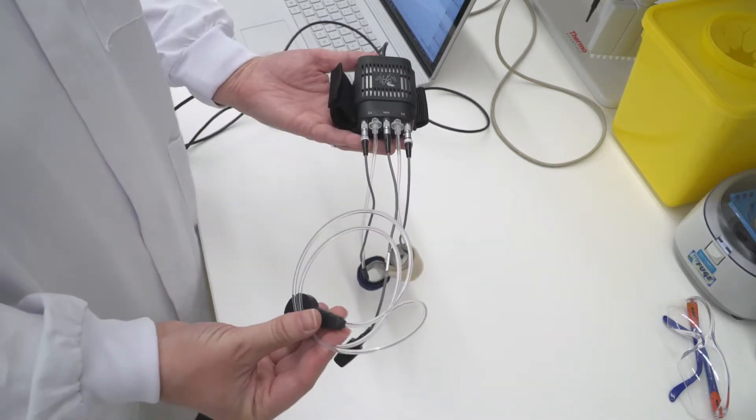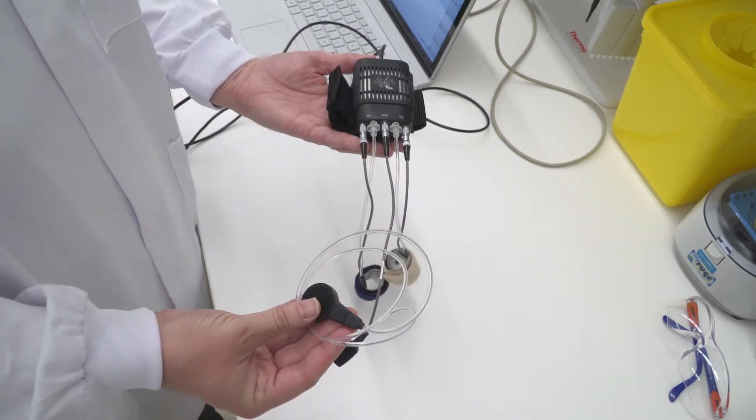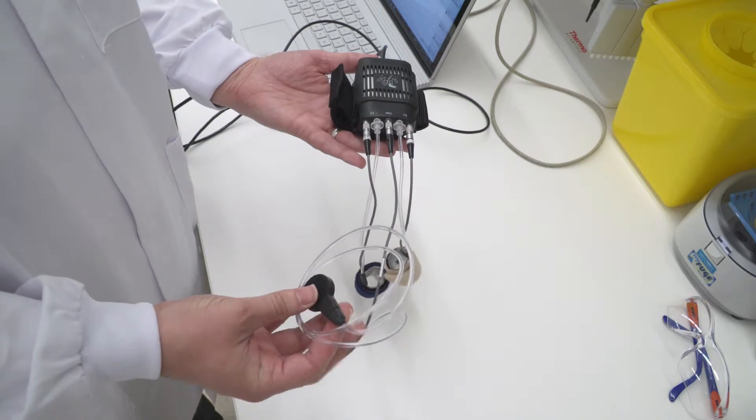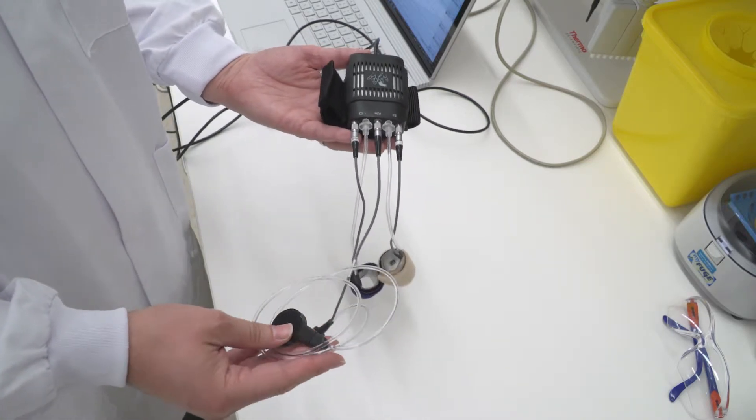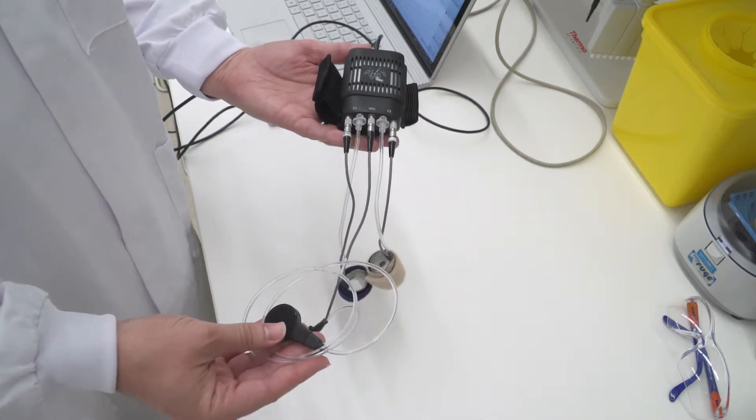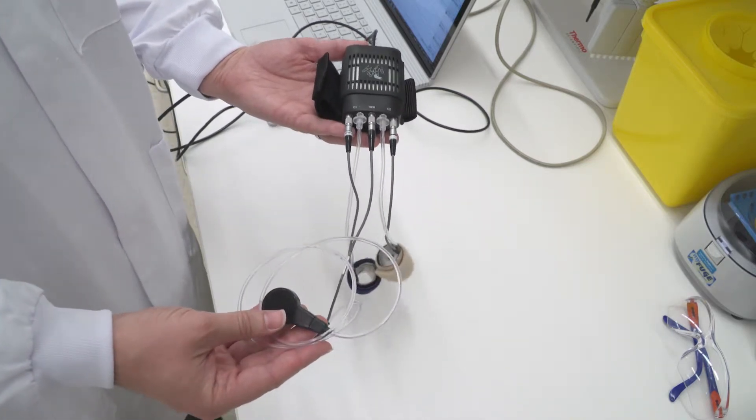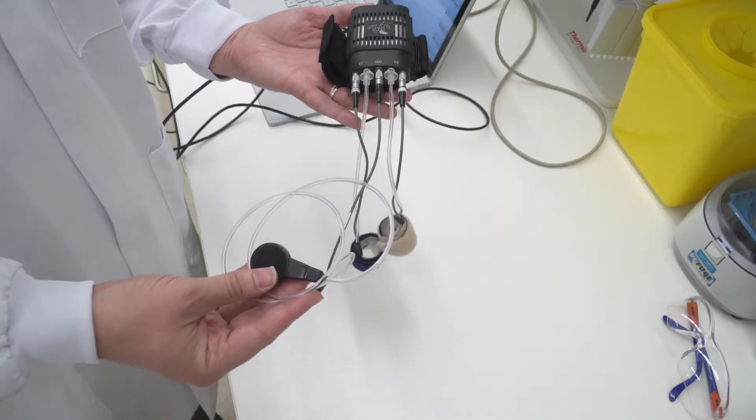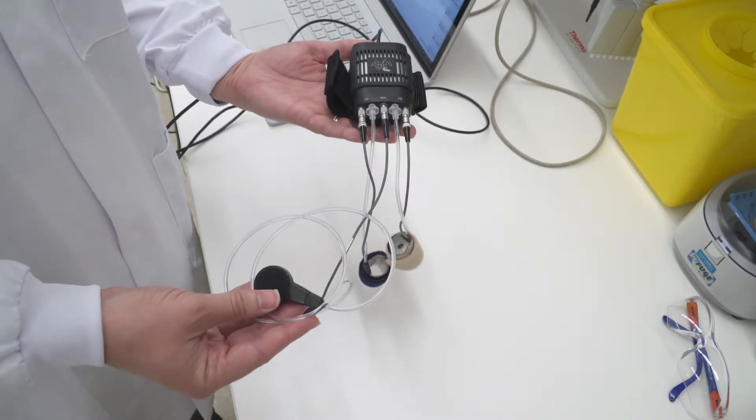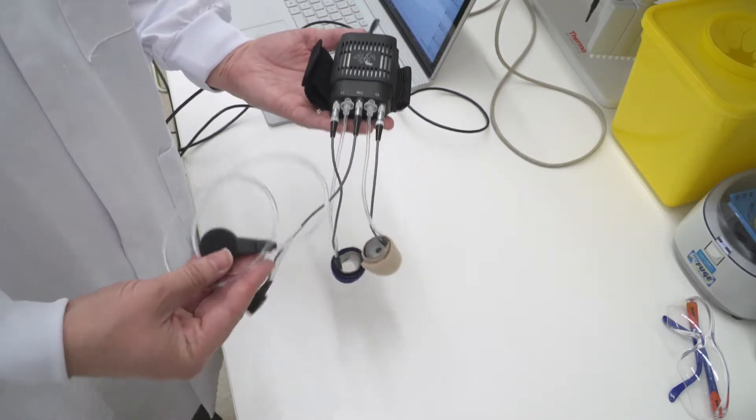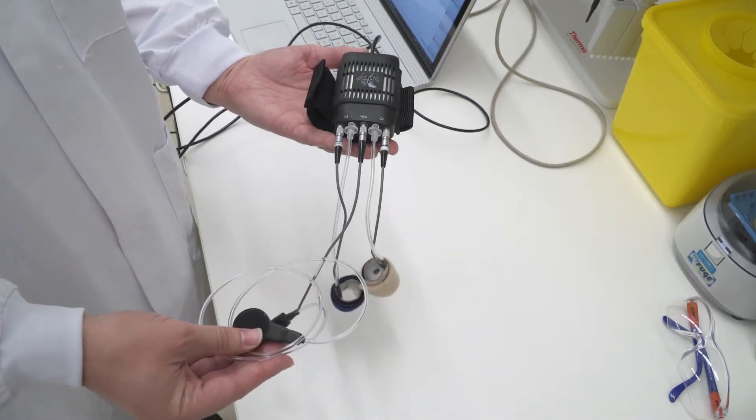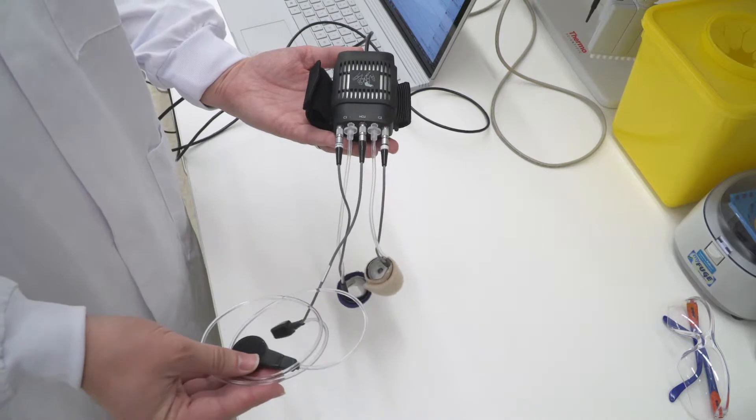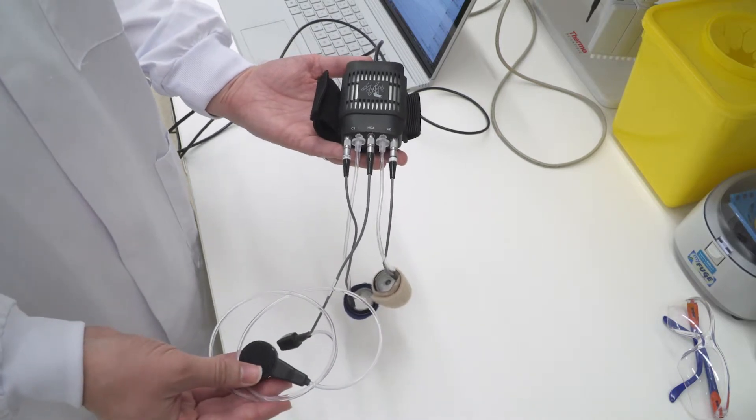Another component is the height correction unit, which allows the system to compensate for height differences between the finger, where the measurement's taken, and the heart, where we care about when we're measuring blood pressure.